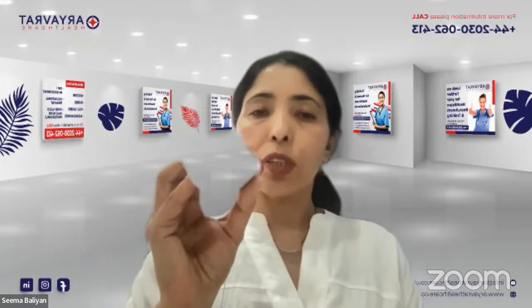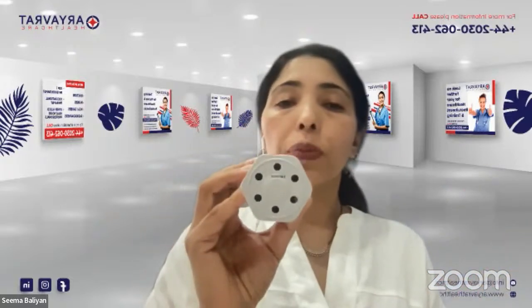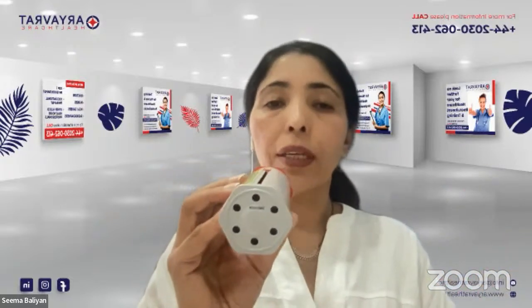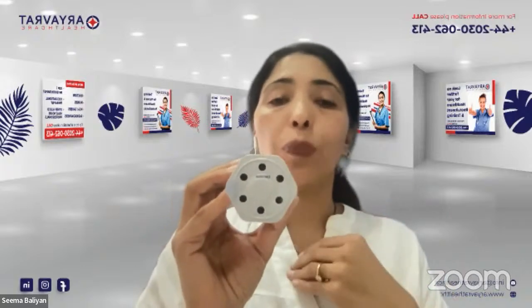So once I have got this position, then I come to the procedure. The procedure is that I will need to take a deep breath in and fill my lungs with as much air as possible.